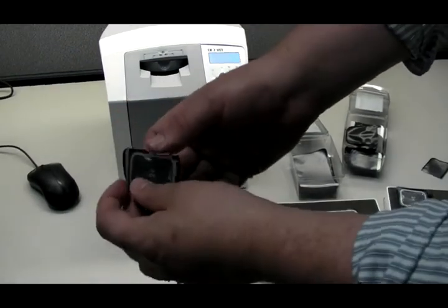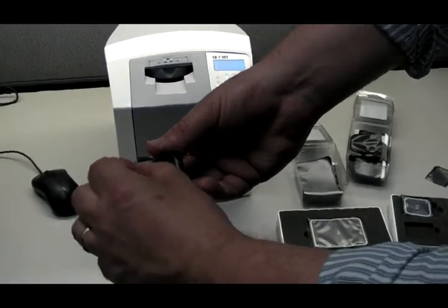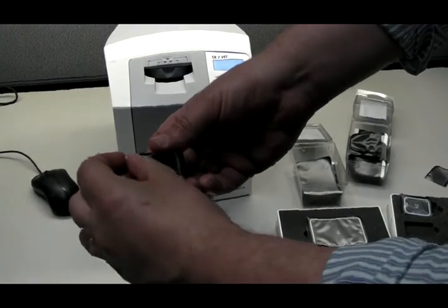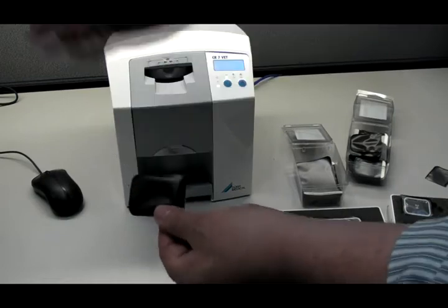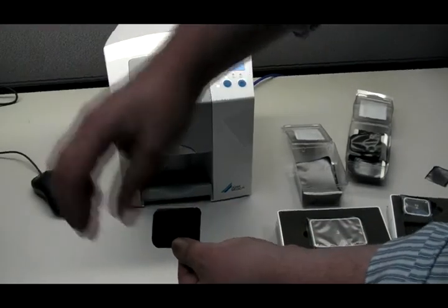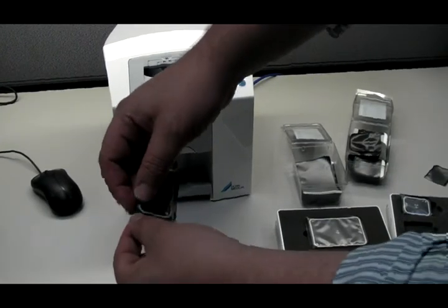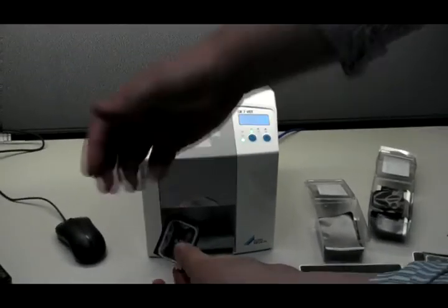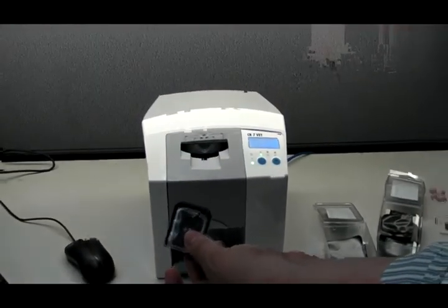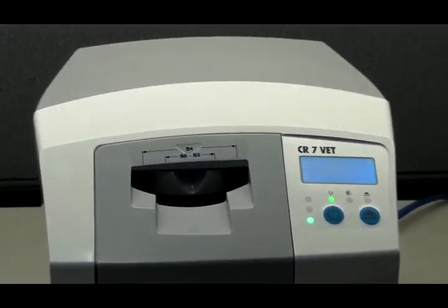You'll then see a sticky. You pull this off, and seal. You will then be firing the X-ray this way, so this is the tube side. You take the X-ray. Once you've taken the X-ray, you tear off here, drying the sheath first to make sure there's no animal fluid on the sheath. Do that again for this one, for an example. Tear off.